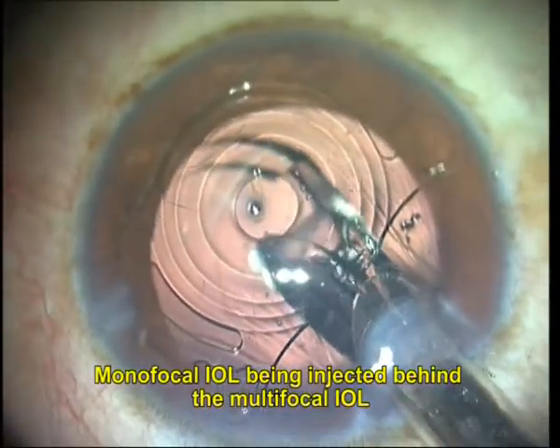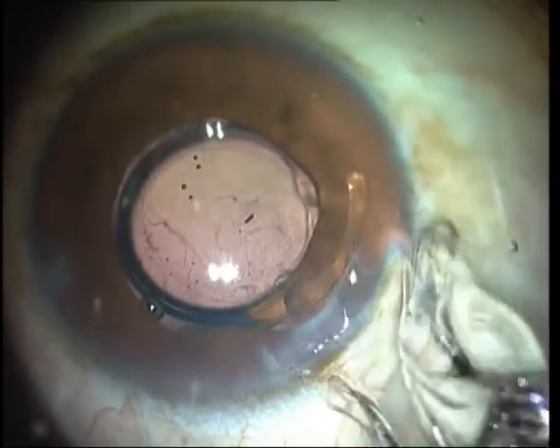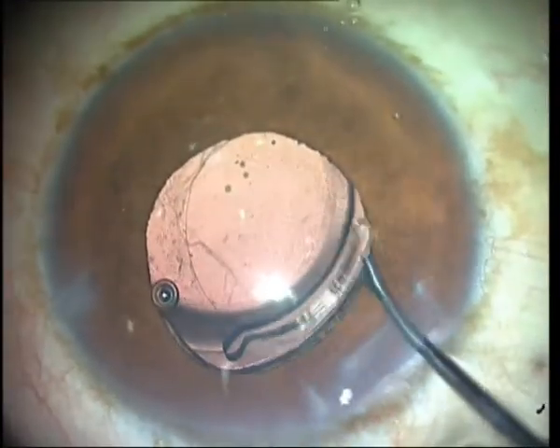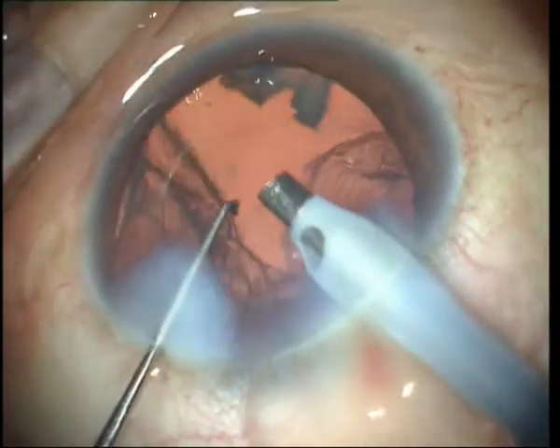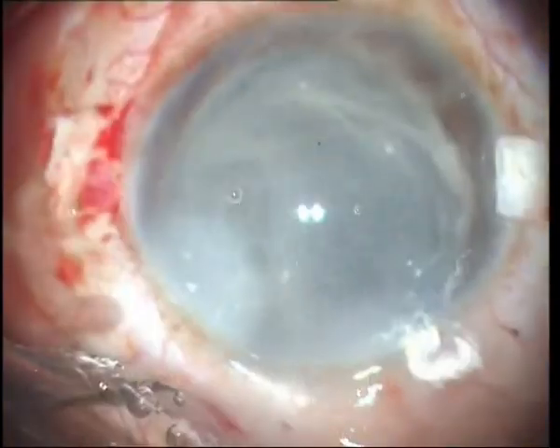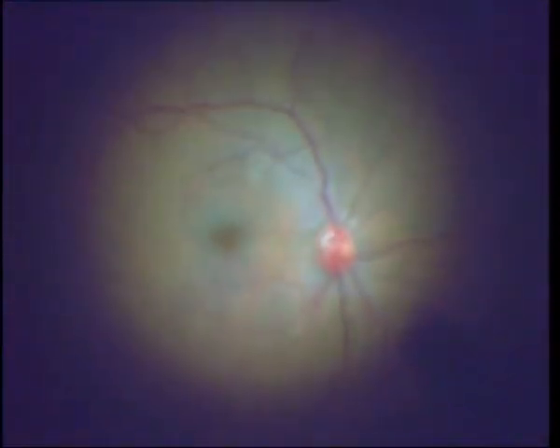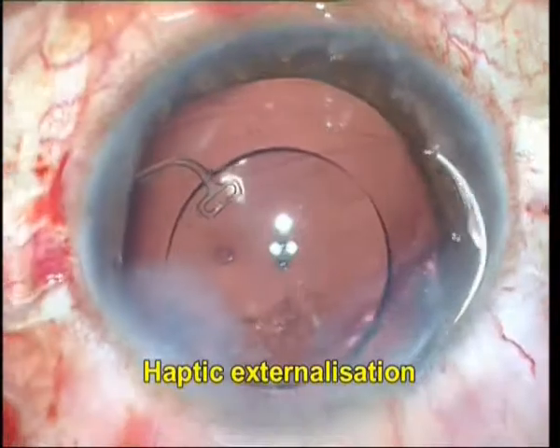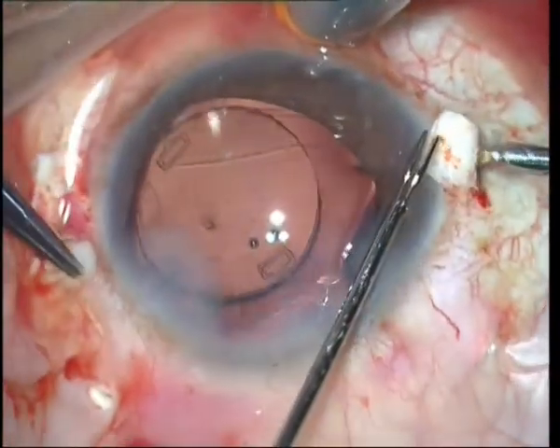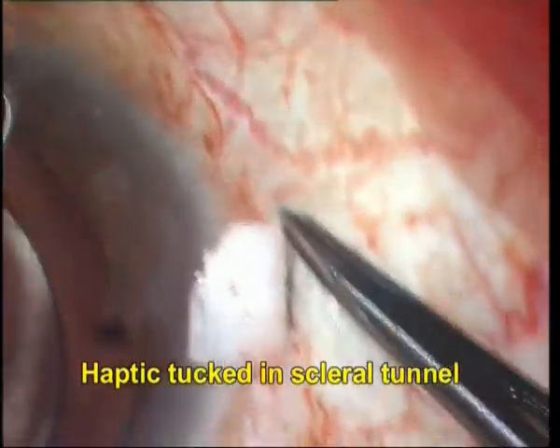A monofocal IOL in an eye with a large angle kappa would not cause as much visual disturbance as a decentered multifocal IOL because of the lack of steps or rings on its surface. There are certain situations where, despite best attempts, a centered multifocal IOL in the bag may not be possible in a patient who is desirous of a multifocal. In such a patient, it is possible to perform a glued multifocal IOL and to adjust the centration by adjusting the location of the scleral flaps, sclerotomies, and the degree of tuck of individual haptics.